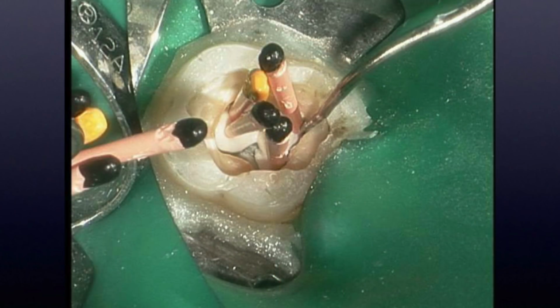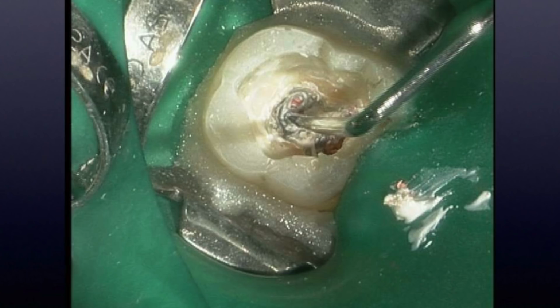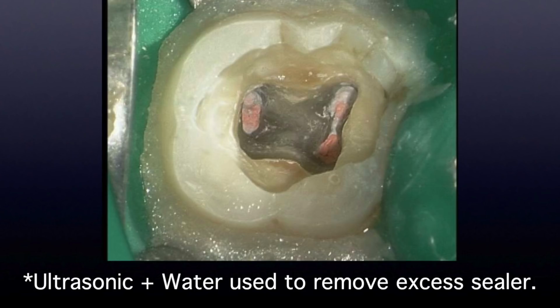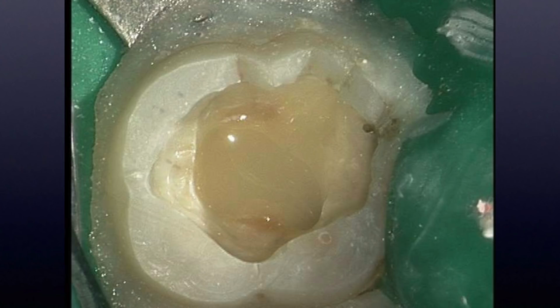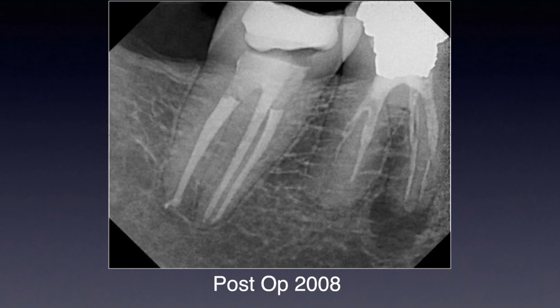Once the cones were seated, they were seared off at the orifice level and were compacted with a size 10 and 9 plugger at the orifice. I then placed a thin layer of glass ionomer over the canals to immediately seal the chamber and reduce coronal leakage before placing cotton and Cavit. The patient left and had the tooth restored.